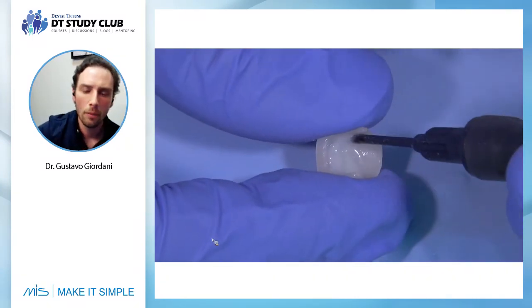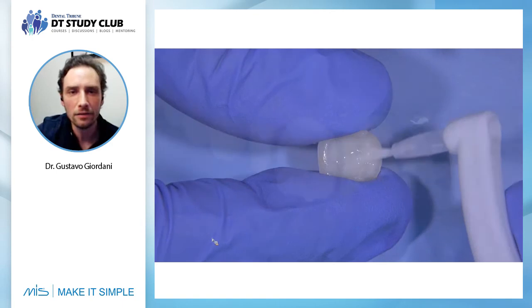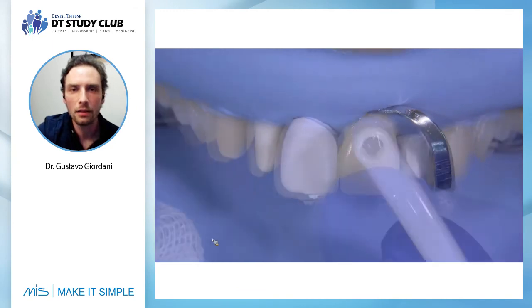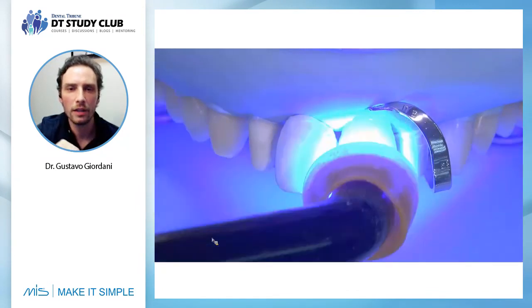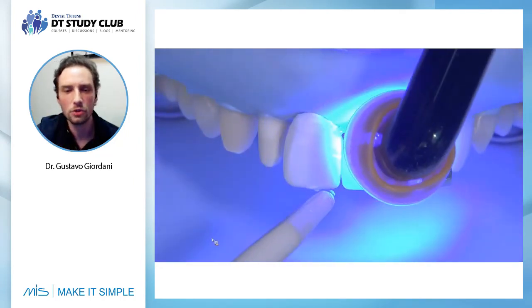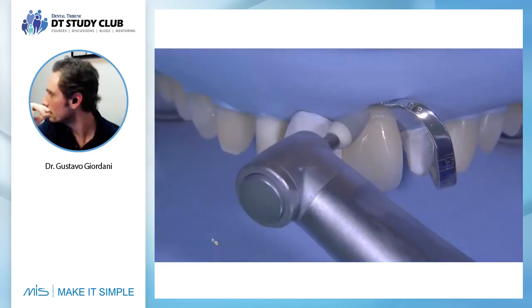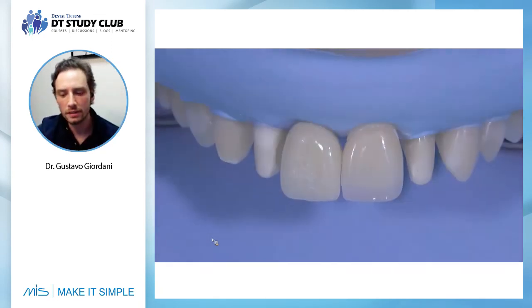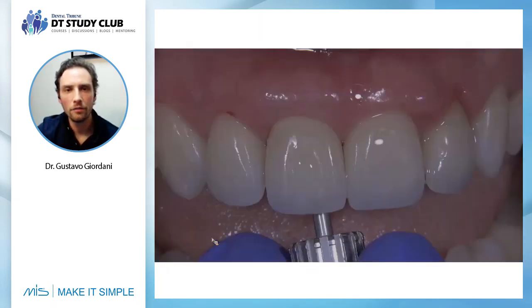So by using the cement now, we're going to cement the final restoration, and we're going to clean very well. We're going to clean very well by using 12D blades, by using rubbers. It's very safe, and you can work in a very safe cementation. This is OxyGuard, just to have a very good polymerization and cleaning of the cement excess. So by using the rubbers, we are removing the excess of cement, and we go step by step cementing our final restoration.